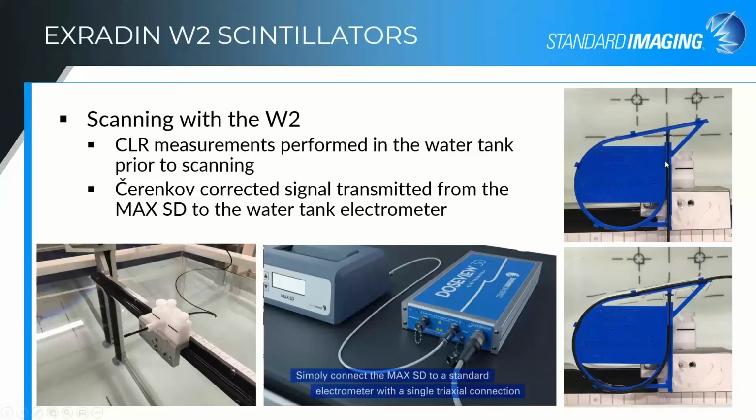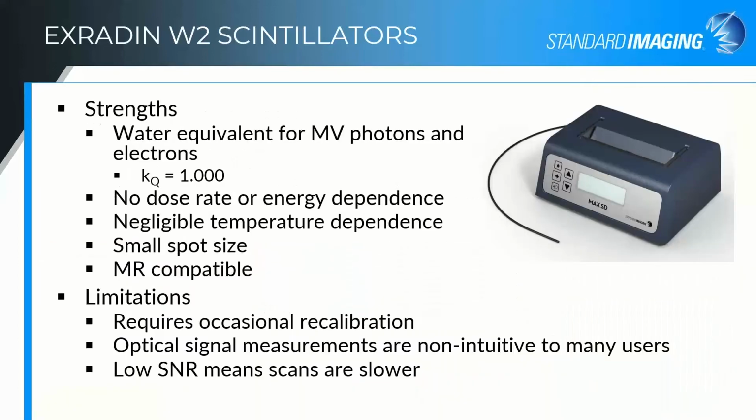And then here, I guess, are images again of if you're doing your characterization, you do your minimum fiber this way, maximum fiber that way. You only have to do that once before you start your measurements. You don't have to do that every time you measure, but you do want to go back periodically and revisit that just to make sure that as you're using the fiber, as that fiber is aging, nothing's changing too drastically with your CLR or your dose conversion.